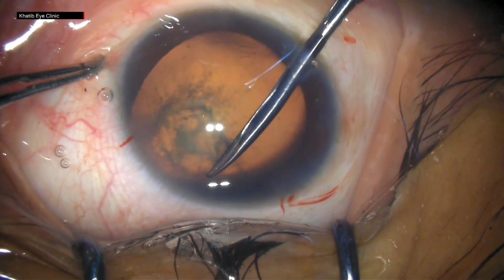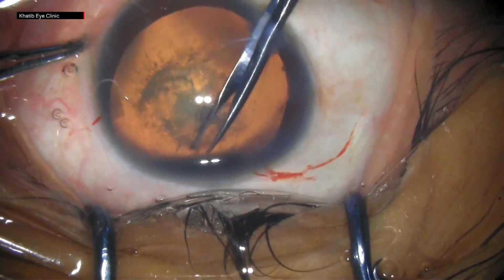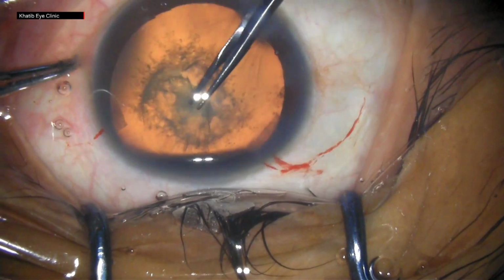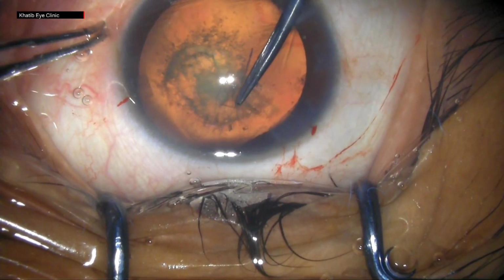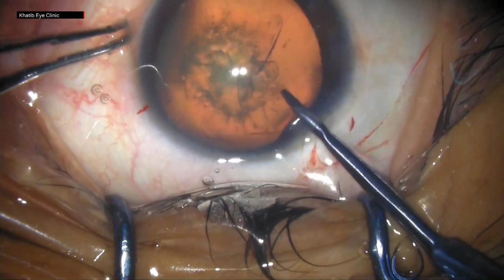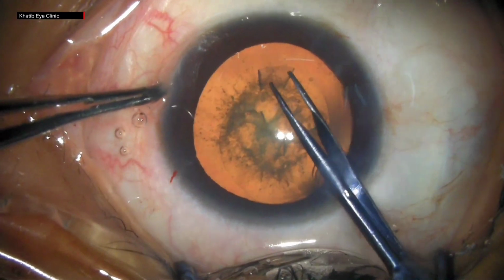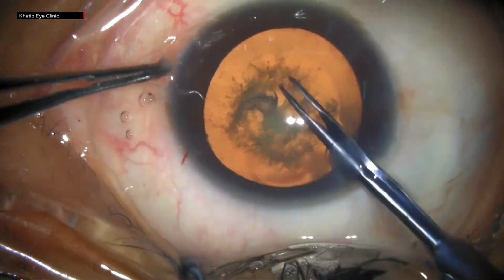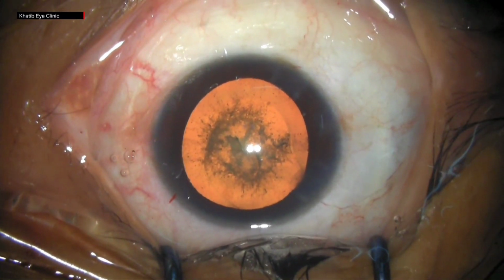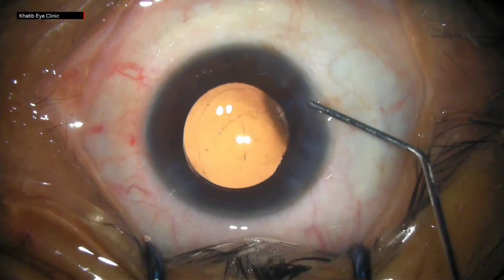Now I try pulling opposite to the tear direction. I pull and pull and pull harder and harder, but in a controlled manner. Eventually, the Rhexis does change its direction and comes inside. I now complete my Rhexis. So as it can be seen, even in this case which seemed very difficult, using the right principles, the Rhexis was completed and we can achieve an in-the-bag IOL fixation.